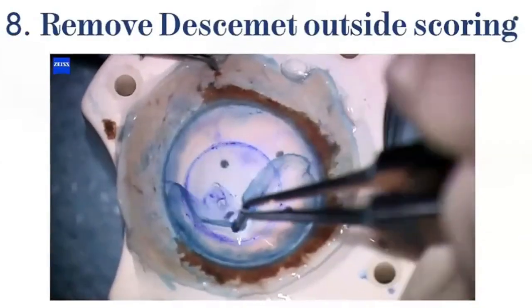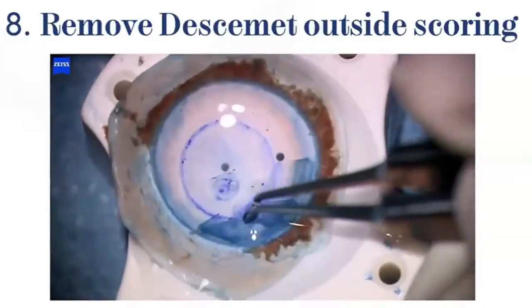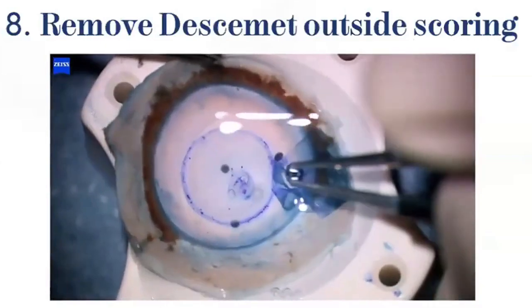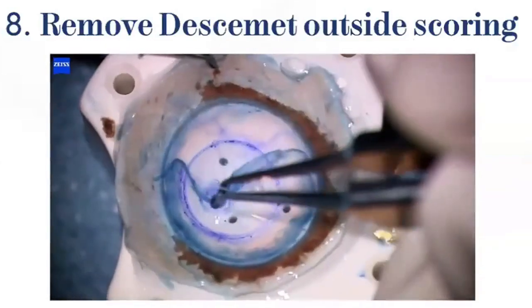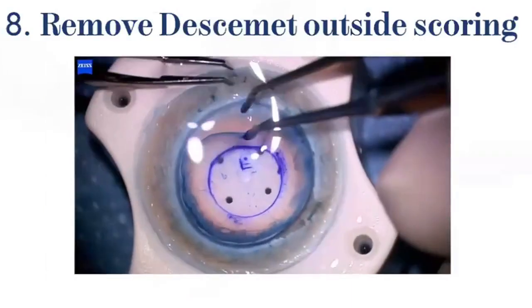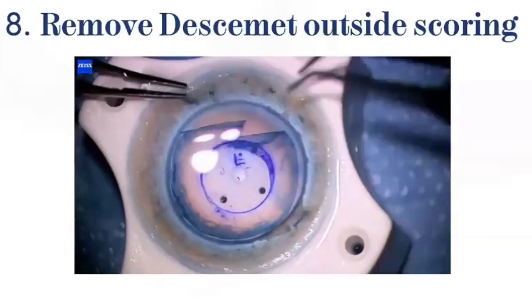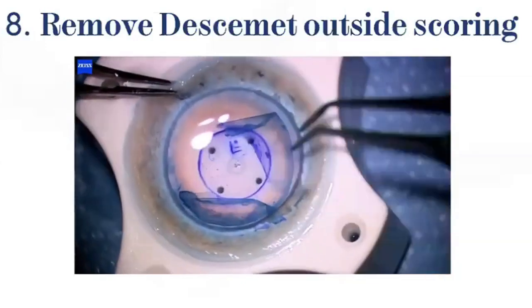Then we will remove the Descemet outside the scoring mark, like we're doing a capsulorhexis. You have to be careful there because sometimes you don't know if you already complete the trephination, and it can be attachments, so you have to be careful there. Other method also you can use to be more gentle is that you can cut with a straight Vannas if it works, and then you go like one side and that's it.